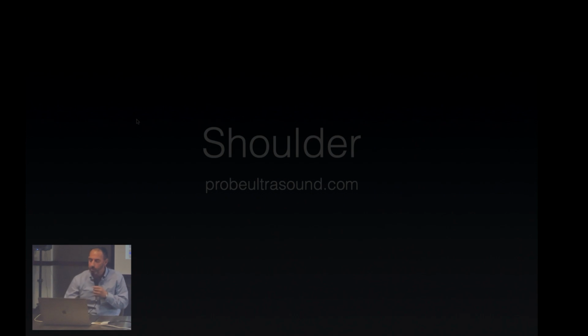All right, so those are basically some common procedures of the shoulders. Are there any questions?